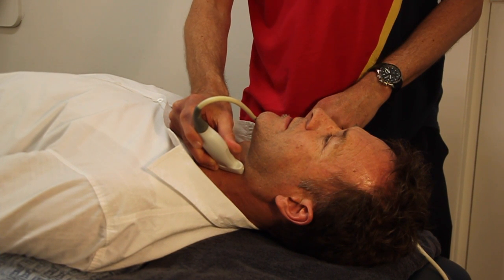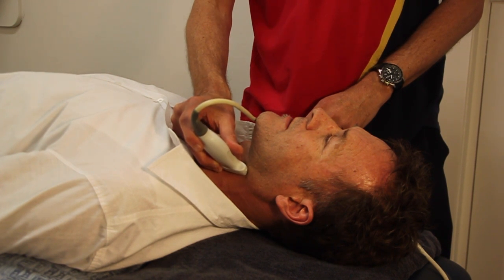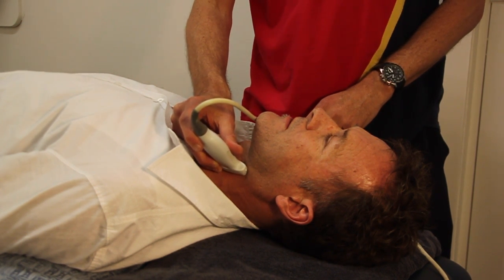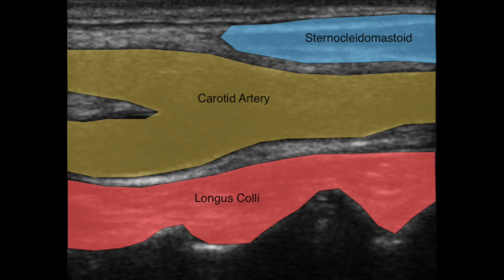The longus colli muscle can be scanned in a longitudinal fashion just lateral to the midline. Look for the pulsatile carotid artery in a longitudinal plane, with the longus colli muscle under this and the cervical transverse processes further posterior.